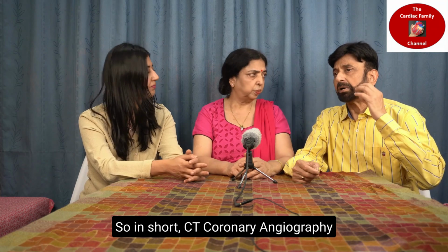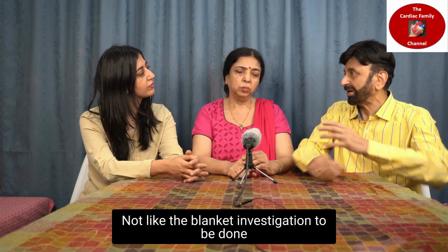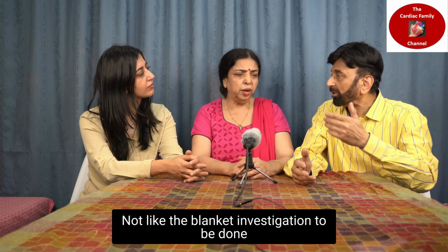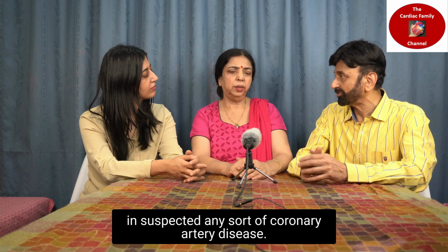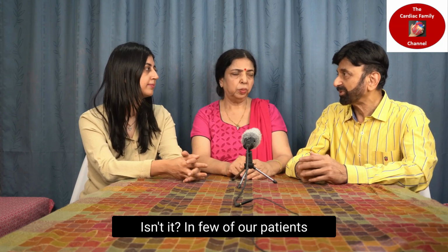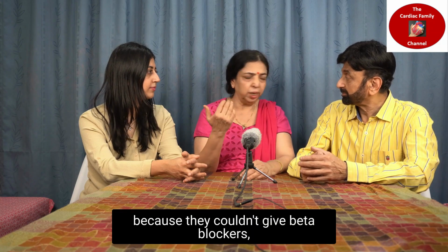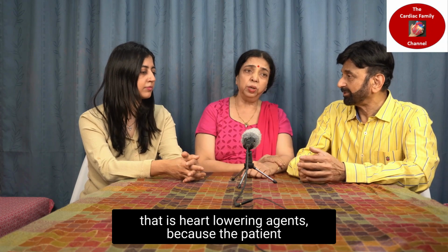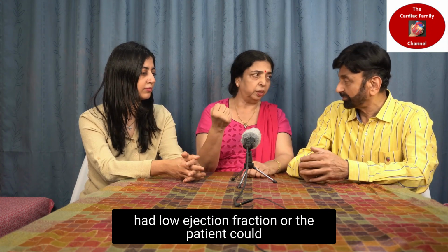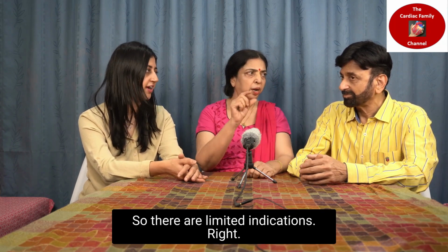So, in short, CT coronary angio has certain specific indications. It is not a blanket investigation to be done in any suspected coronary artery disease. In a few of our patients, we couldn't give a beta blocker, that is a heart rate lowering agent, because the patient had low ejection fraction, or had a side effect to it. Then there is no other option but to do a conventional coronary angiogram. So there are limited indications.